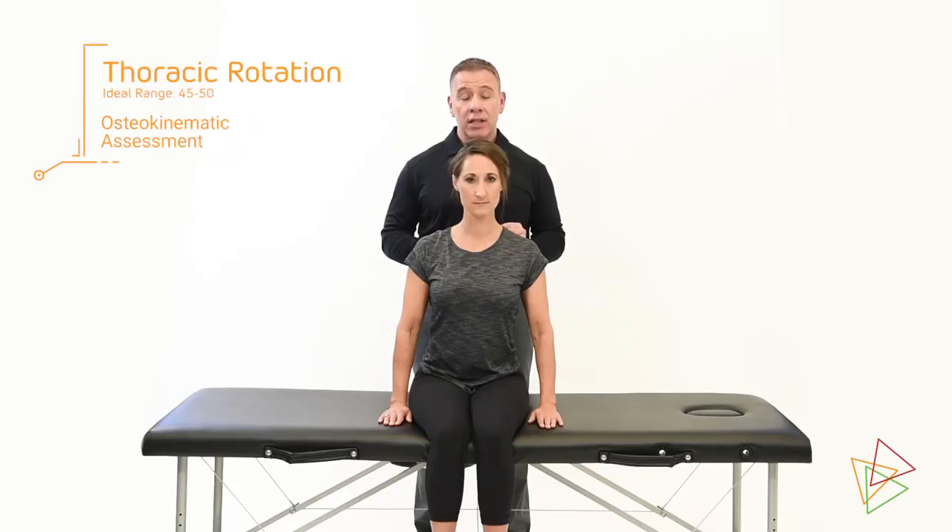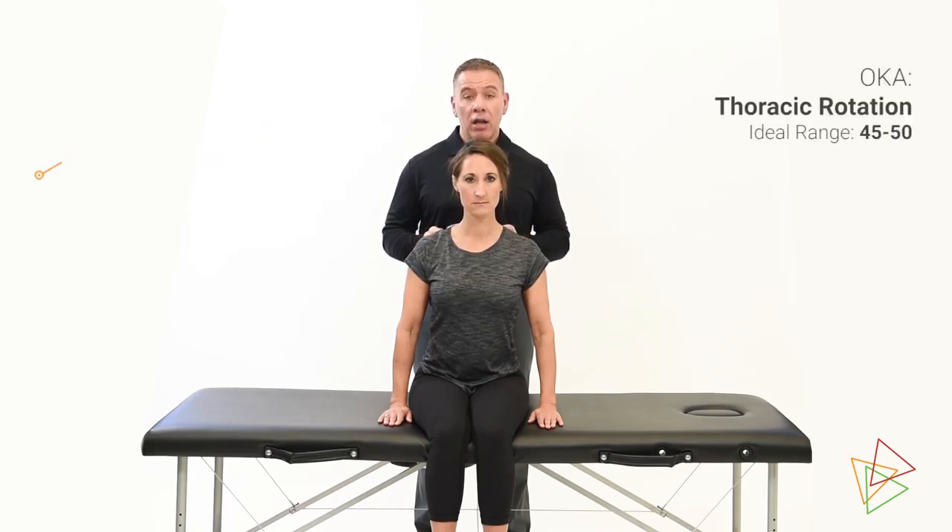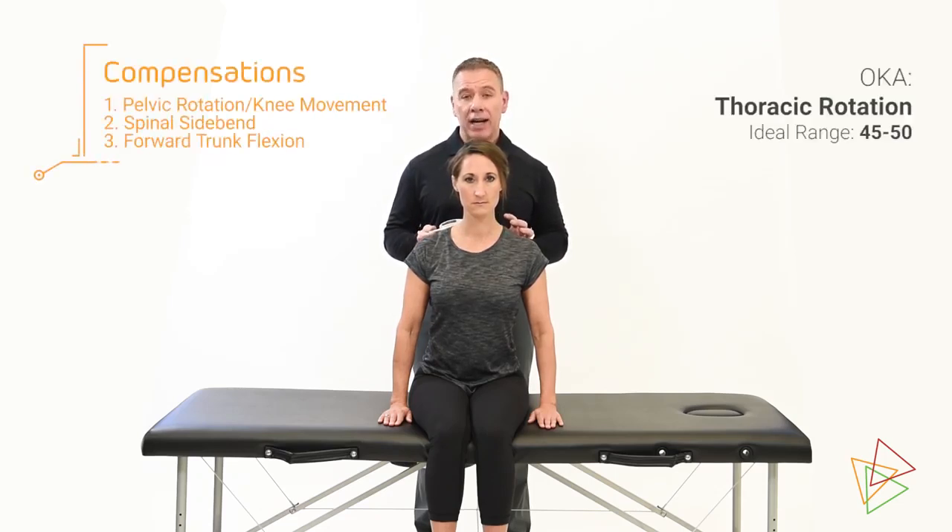When measuring thoracic rotation, it's important that the person is sitting on a chair or table, with that chair or table against the back of their knees. This helps avoid any compensations that may occur throughout their spine or pelvic complex that may change our final range of motion. We also want to make sure that they're sitting in their natural postural position, not trying to extend their spine or correct any postural imbalances that might be there.